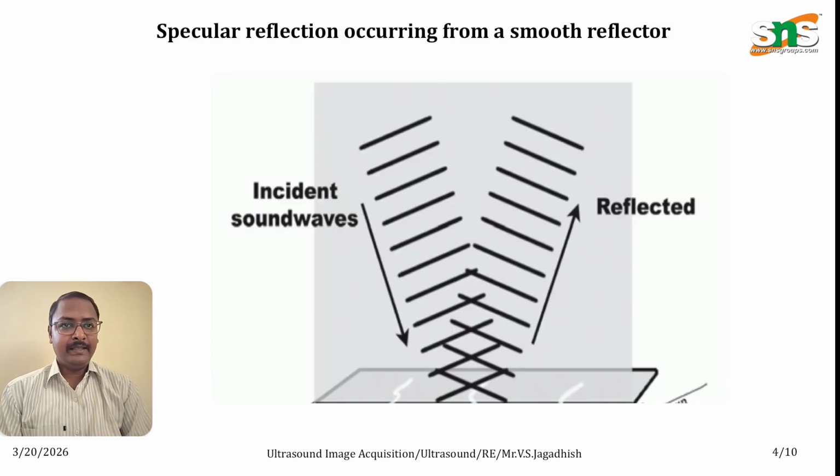The same thing applies when you are transmitting. Here you can see that the incident sound wave is the sound wave produced from the ultrasound transducer. If the produced ultrasound is at a certain angle, for example 30° or 40° incline towards the surface, then the reflected ultrasound waveform will also have a certain angle of deviation with respect to the surface.